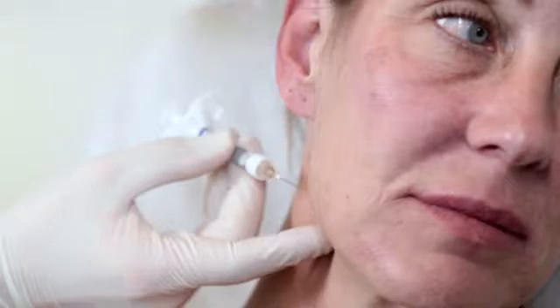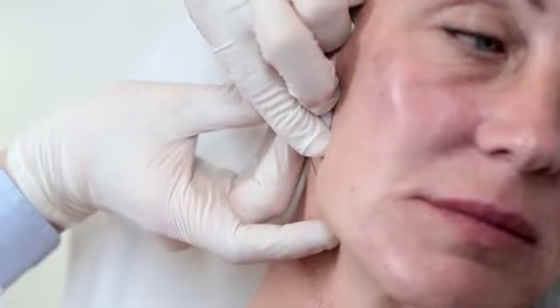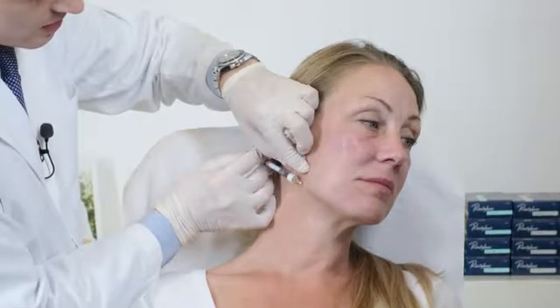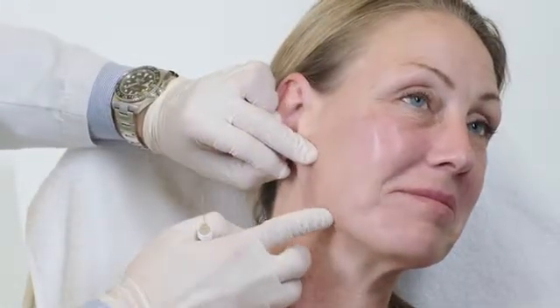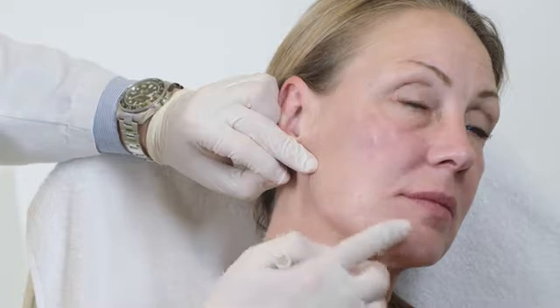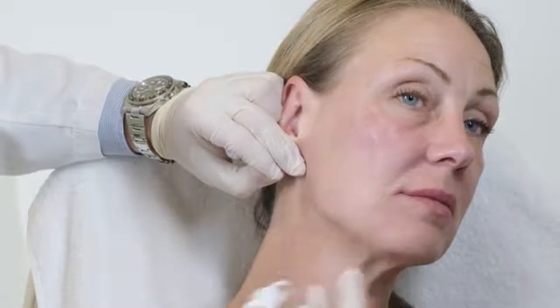Here we go, a little massage, and we continue with the mandibular angle to pull back the tissue and to create a nice and elegant mandible for Emmy. When injecting this area, make sure that the cannula will not touch the earlobe. Roll your cannula in a superficial plane along the lower angle of the mandible until the mandibular ligament, and then inject slowly as you retract. This way you create support all the way around the mandibular angle, helping to pull back the tissue, and together with the injection of the anterior aspect of the mandible creates a more elongated look and a very nice profile for your patient.